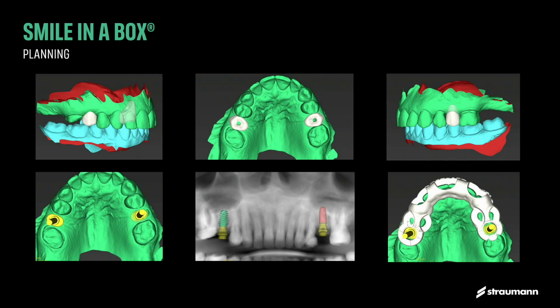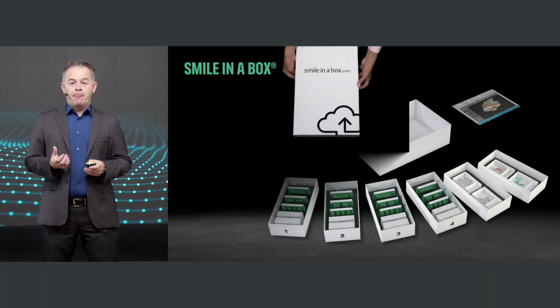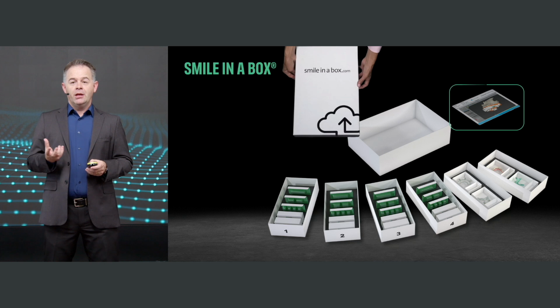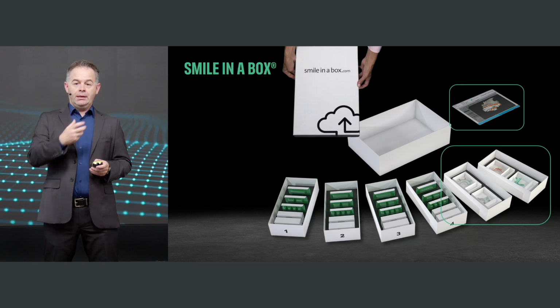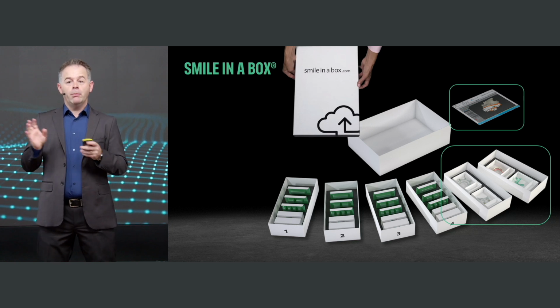We also ask them to design the guide, because we're going to do this surgery with guided surgery for a more precise placement. So you see the guide has been designed, and next thing you know, a box will be sent to you. And when you open it, you see the planning that you ordered. You will receive also a box with the guides, because we ordered the planning, the design of the guide, and the guides. We also ordered the models.